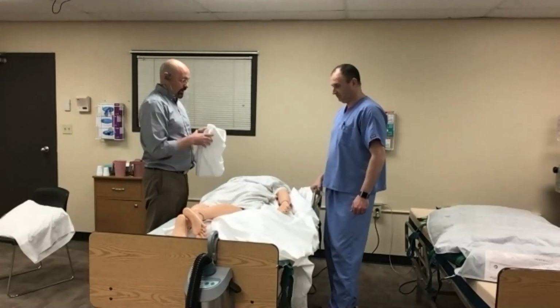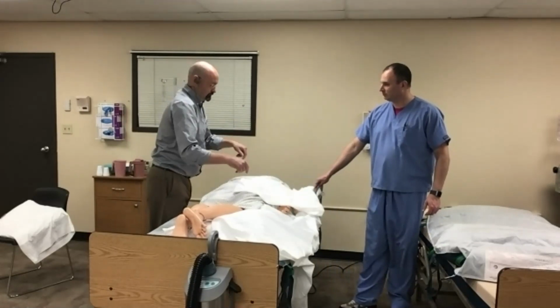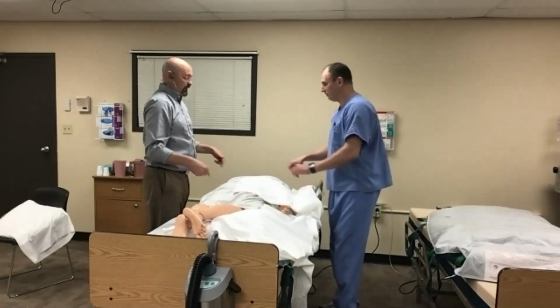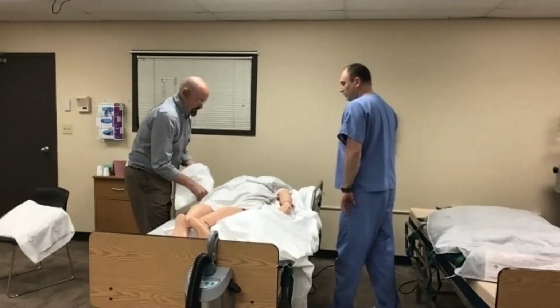Good. All right. So which way do you want to go? Back towards you. Perfect. Go. Oh, no, no. Toward me. Go on. So the arm that gets tucked is always the one that is going to be rolled on.